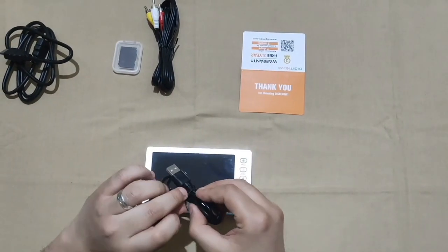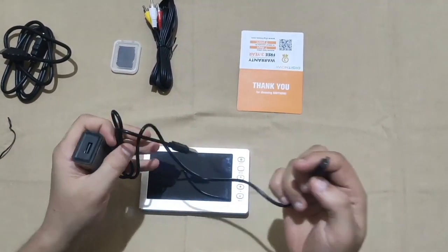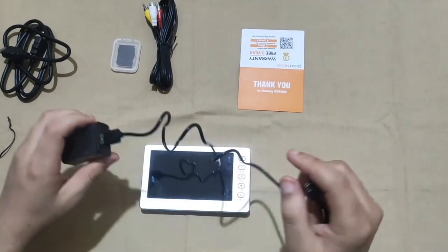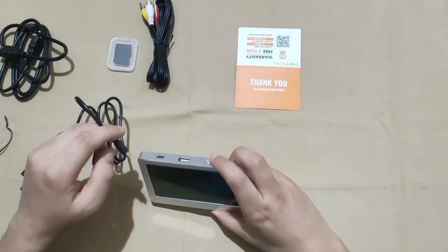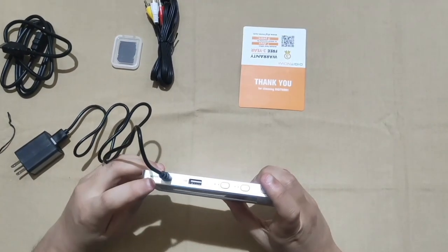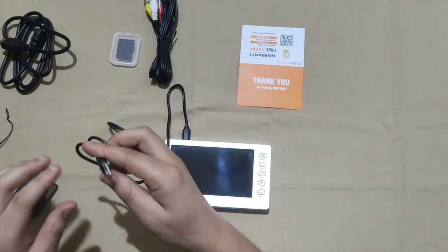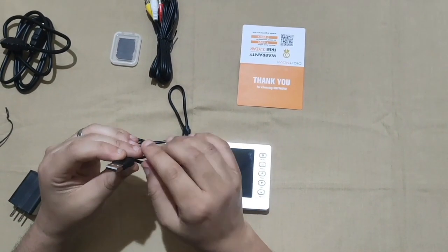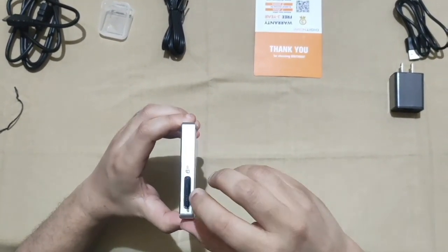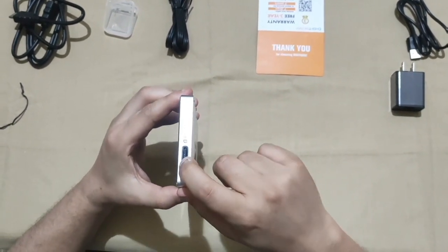To charge the battery, connect the Type-C USB cable into its socket in the video capture box. And connect the other side of the USB cable into the power adapter or into the USB socket of the computer or laptop. The SD card is inserted into its socket by this way, as you can see, and is ejected by pressing over it.